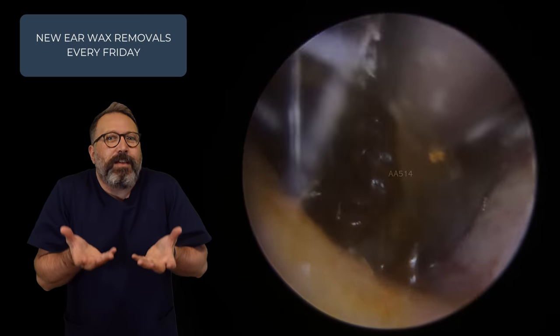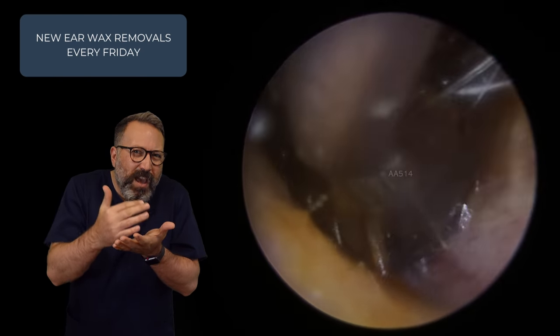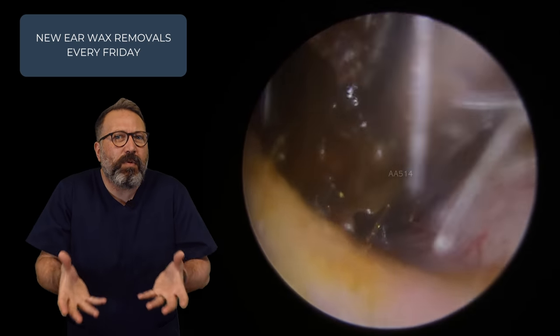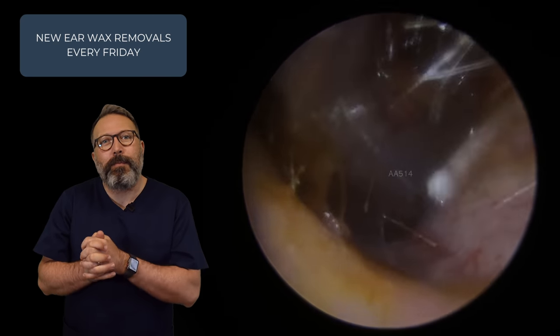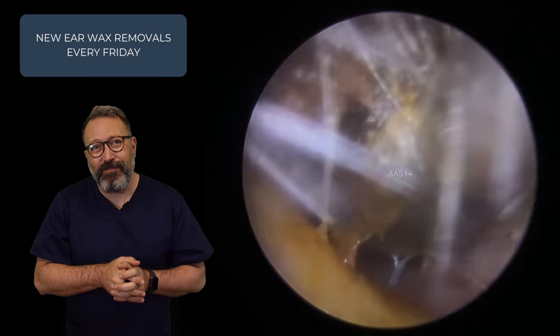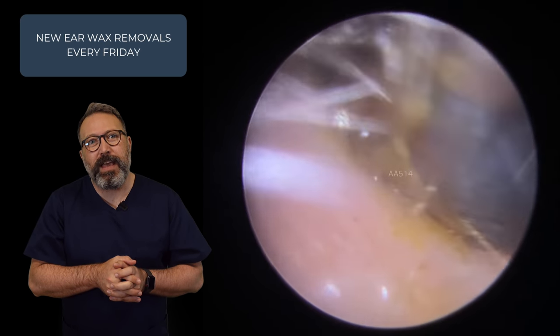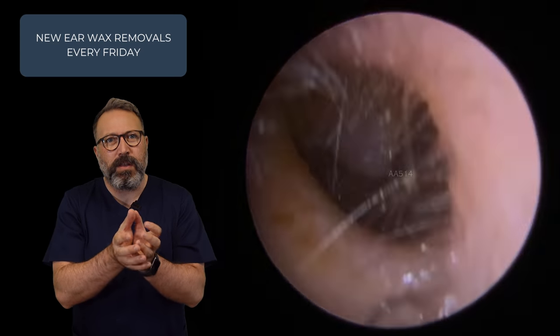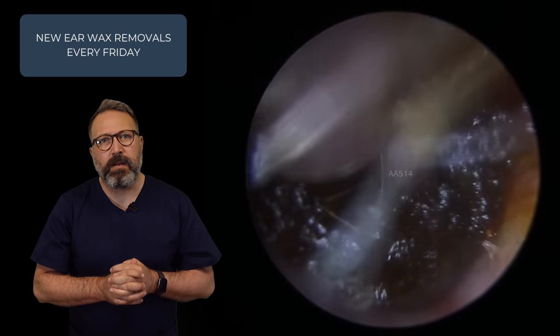I'm trying to lift from the bottom to detach it. You'll see that slightly greyer section — that's a little bit of dry skin, so that tends to peel away from the canal wall. We're turbo wiggling again, trying to get this out — it doesn't want to budge. It is very at home in there. Oh, now it's going. We just saw that last little bit coming forwards and managed to turn the wax a little bit. Almost a spherical plug of wax, that one. What's behind that? There's a little bit more back there as well. Look how deep that wax was going — you can see how these patients really struggle with their hearing, especially when it's gone very deep and plugged it completely.